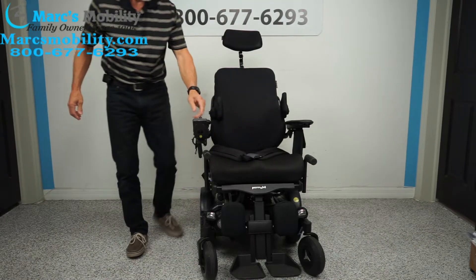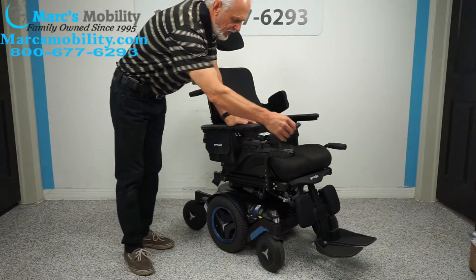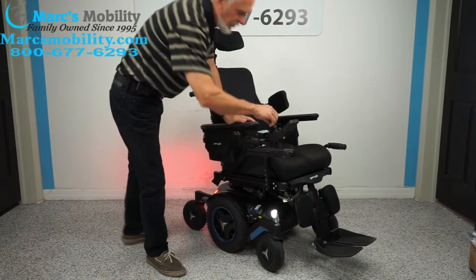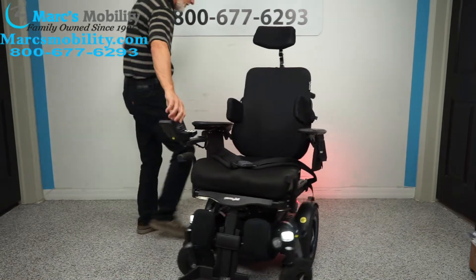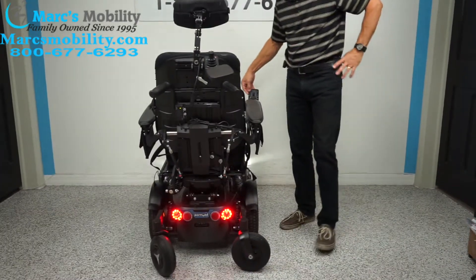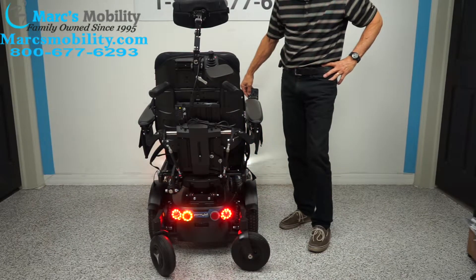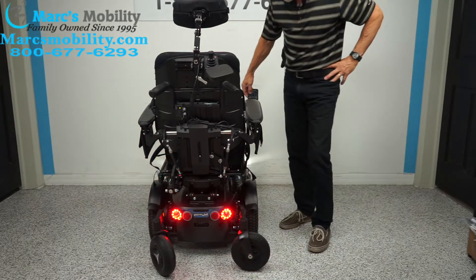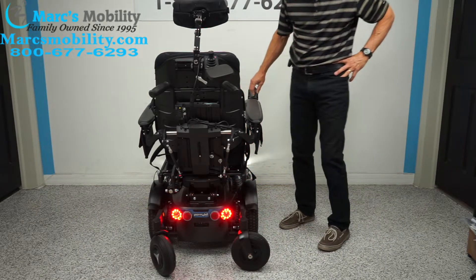Also on this chair, you've got headlights and tail lights — these are real factory lights. Look at those lights in front and look at the lights in the back. You also have hazards, left flashers, and right flashers. Fully equipped lights on this chair.